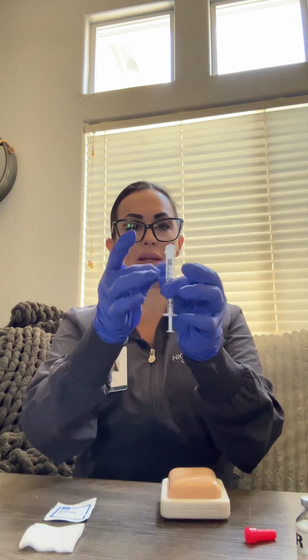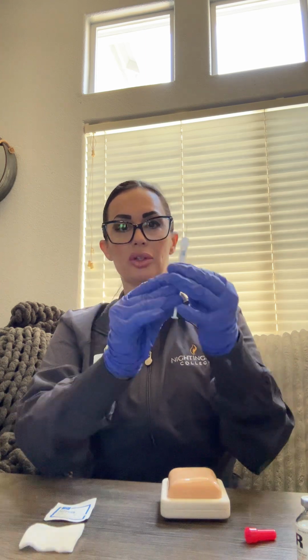You will also want to make sure that you get rid of any air bubbles and push up on the plunger if needed. You will want to make sure you select the appropriate site. You will verbalize if you see any lesions or any skin discoloration, and you will palpate for tenderness. If you see anything, you will use a different injection site.